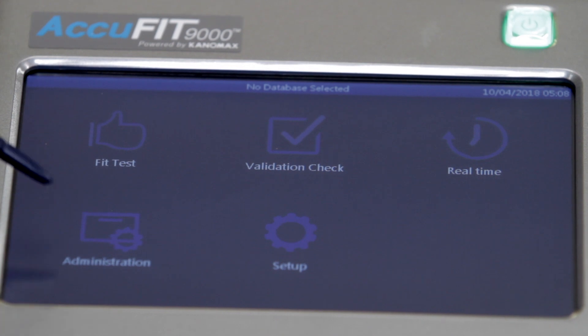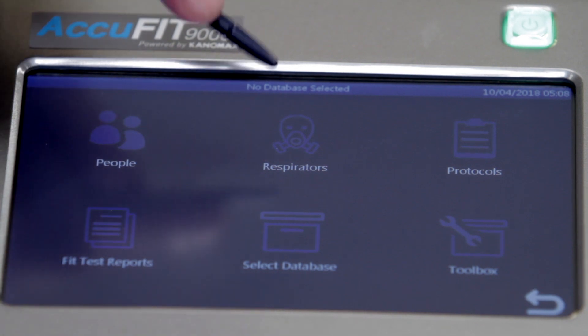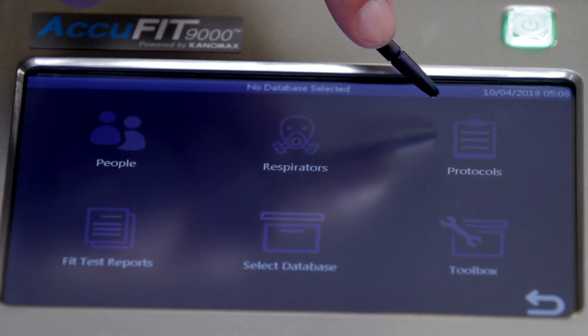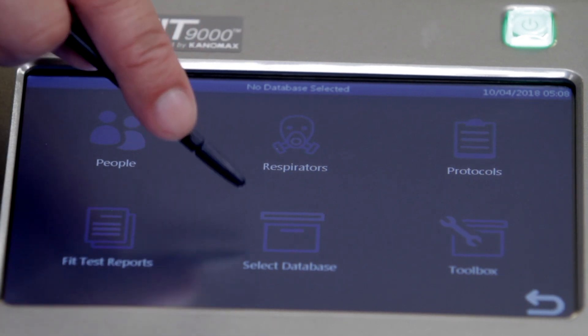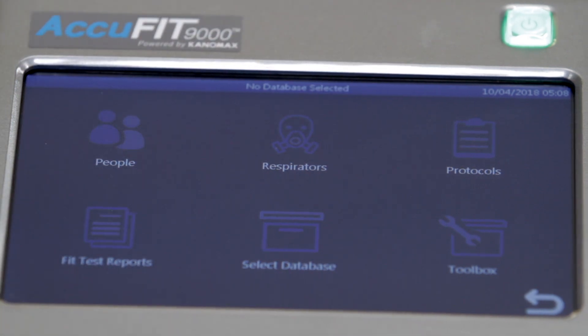Within the administration menu, users can access People to add or delete people from the database, Respirators to add or delete respirators, Protocols to select the test protocol, Fit Test Reports to display fit test results, Select Database to load a database, and Toolbox for advanced database functions.